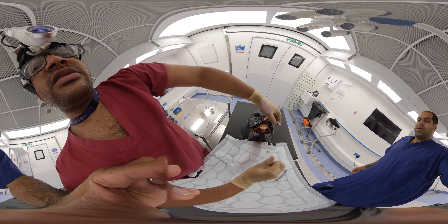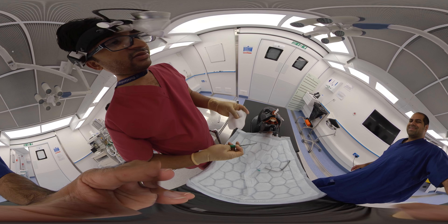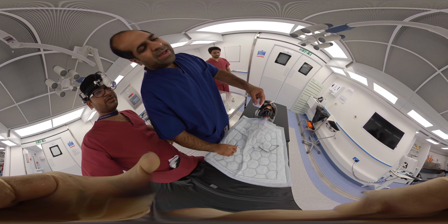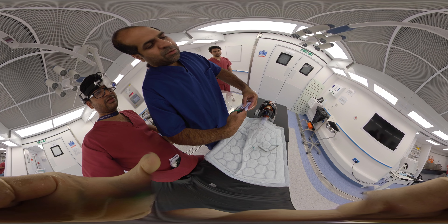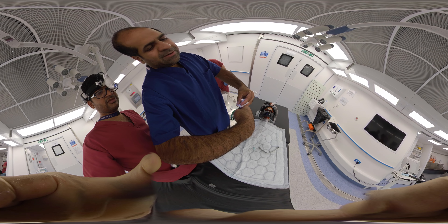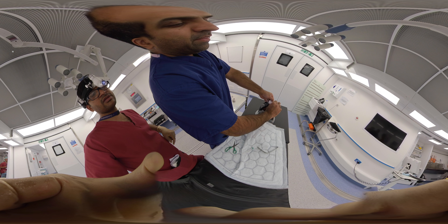To prepare the gauze: take a piece of gauze, fold it once, fold it twice so it forms a square, then cut a small aperture in the corner. You can also make a little cut to the side so that it wraps around the nasal alar.